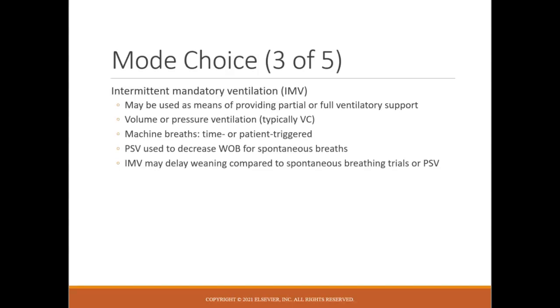Again, spontaneous breaths are breaths that have to be triggered by the patient and have to be flow cycled by the patient, meaning that once the vent senses a reduction in the flow rate, the patient's inspiratory flow rate, excuse me, it will cycle into exhalation.